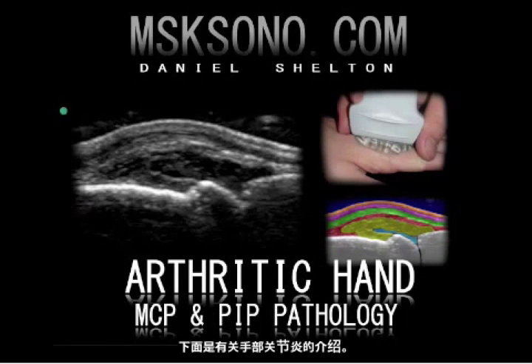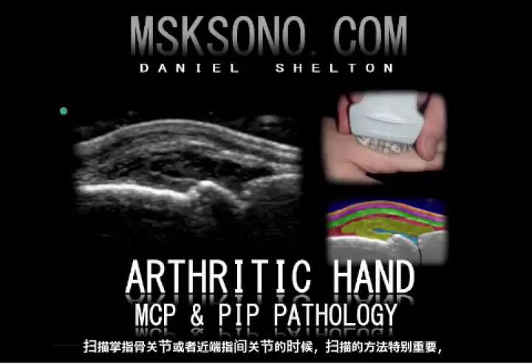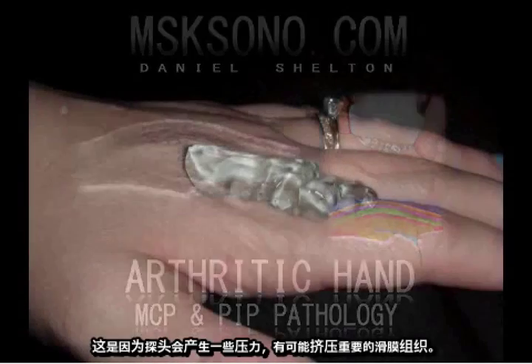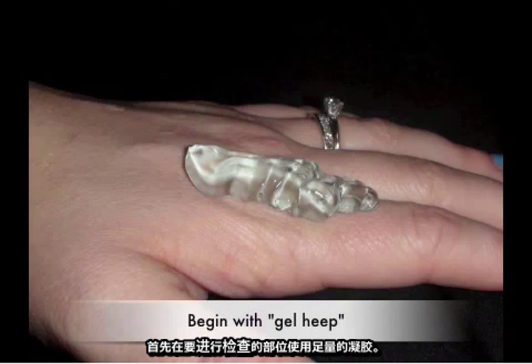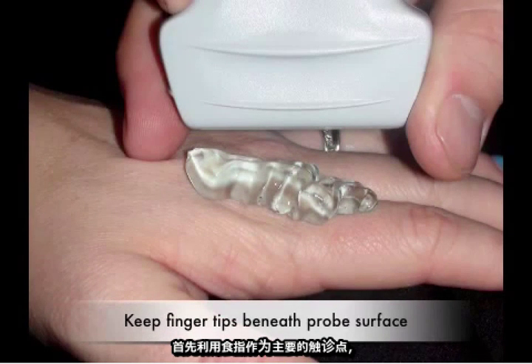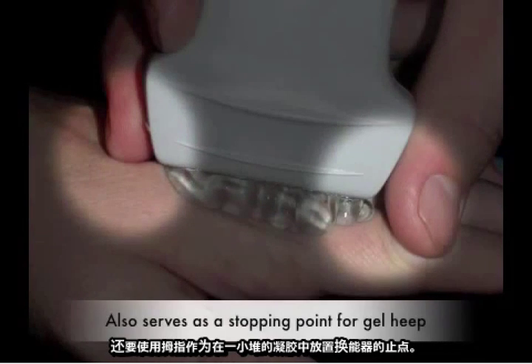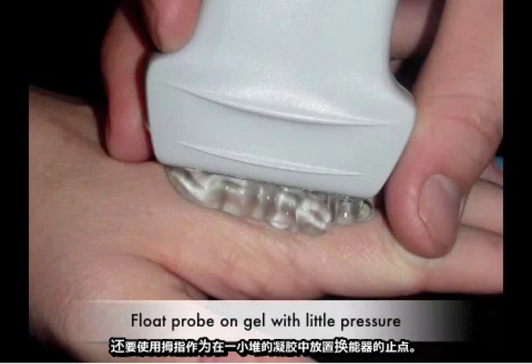The following is an introduction to the arthritic hand. Scanning technique is of particular importance while scanning the metacarpophalangeal joints or the proximal interphalangeal joints due to the slight transducer pressure and its capability of compressing useful synovial tissues. Begin with copious gel heaping over the area of interest. First utilize the index finger as a primary palpation point as well as a stabilizer for the ultrasound transducer. Also use the thumb as a stopping point for the transducer's depth over the gel heap.